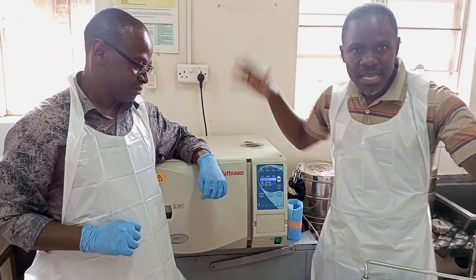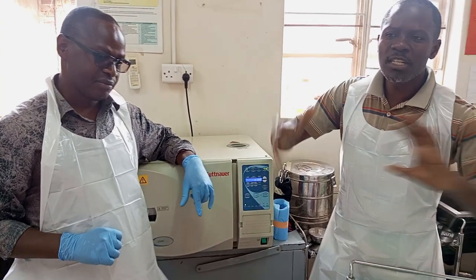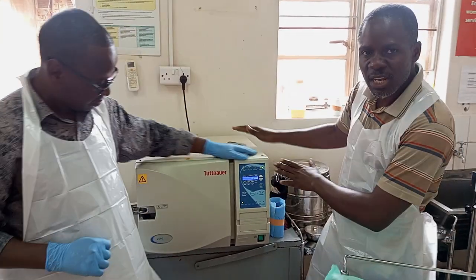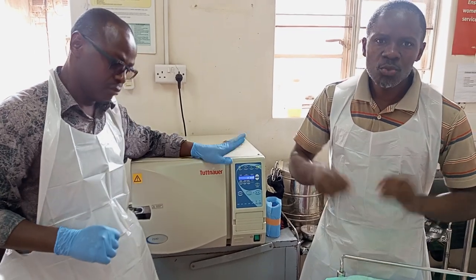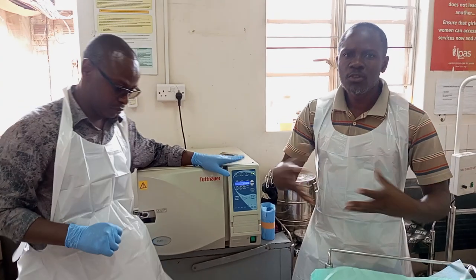So there are also bigger sterilizers, or autoclave machines. Very big ones that accommodate very big drums and also very big packs. Okay? So this one is a smaller version, but there are also bigger machines. So let's try to always ensure that as we work in this hospital environment, we keep our instruments sterile.